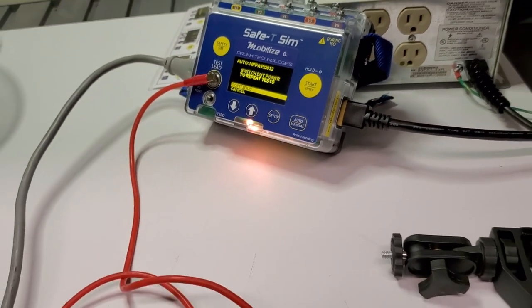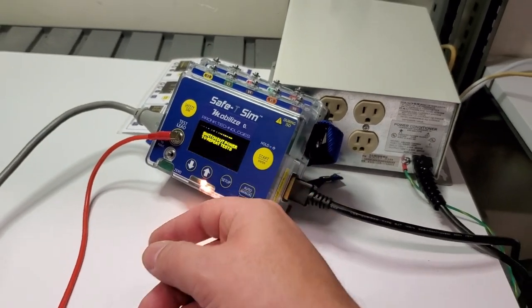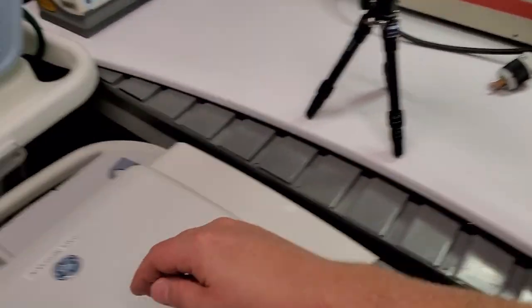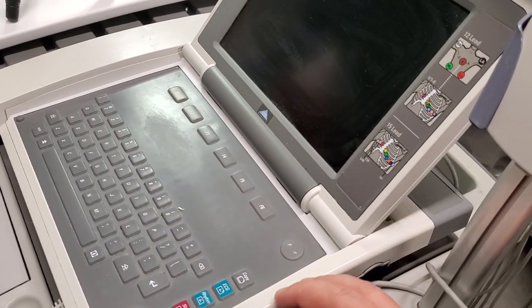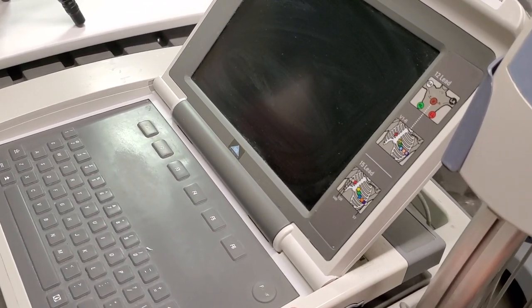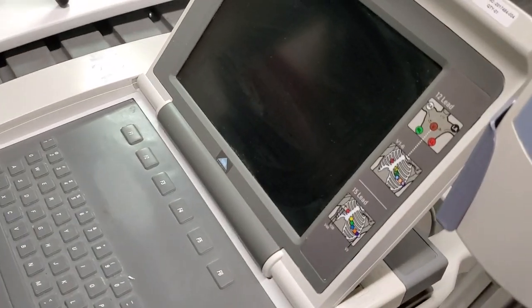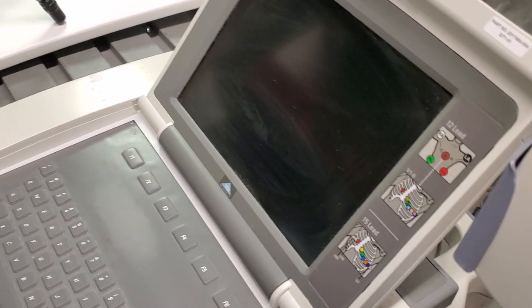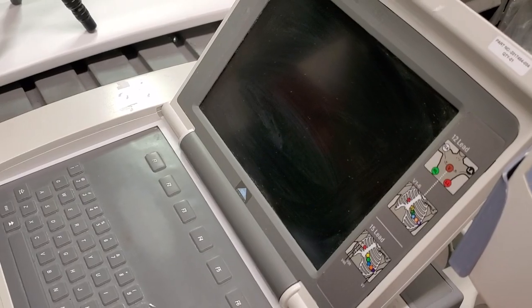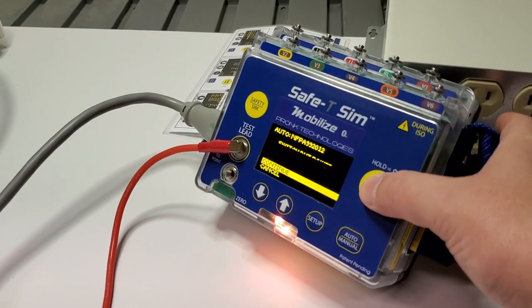Now it's telling me to switch the device under test power on to repeat the test. So here's where I go into the unit — the power button's all worn out, so we boot it. This device is broken, but we're going to go ahead and tell it to continue with the test anyway.